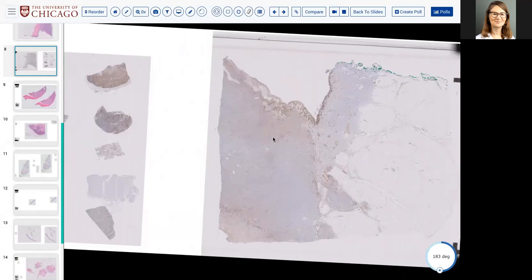What's the only real difference that we have in our pockets for which we call one and the other? Those can stain CD99, right? I don't remember epithelioid sarcoma staining for that. I don't know, but a lot of things that stain for keratins can also stain for the CD marker. So I also am not entirely sure. And then S100 too.